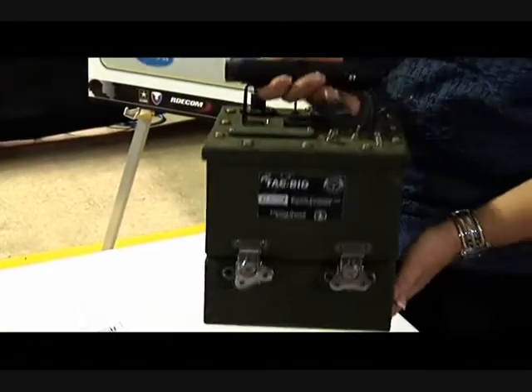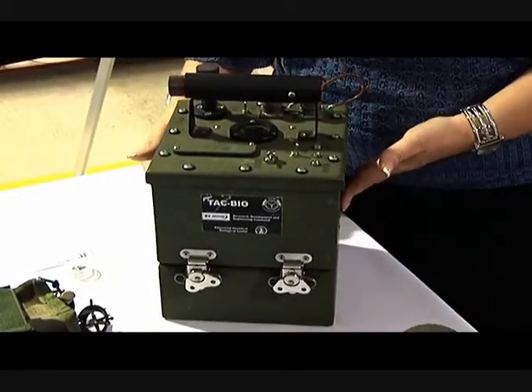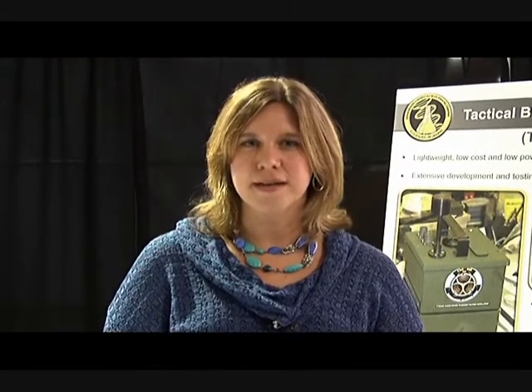Today I'm going to talk to you about the TAC BioDetector. It's well known that one can detect biological agents using laser-induced fluorescence. Unfortunately, the lasers required and the associated optics required are costly and result in a detector that is well over $100,000.